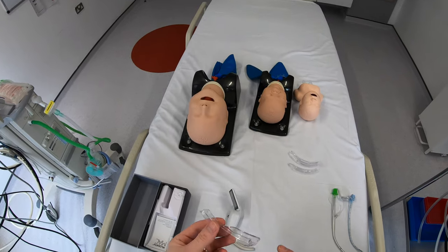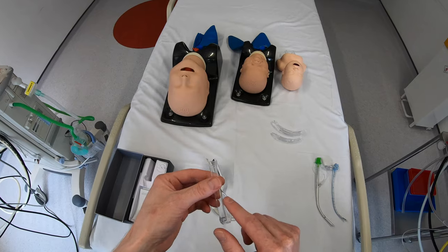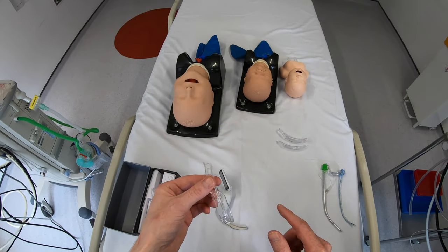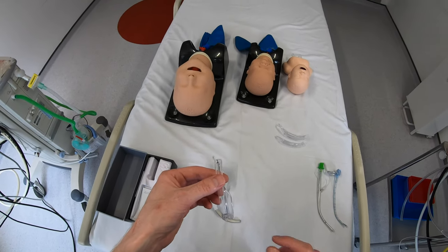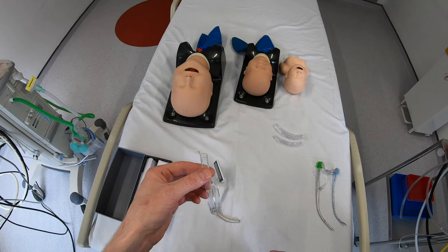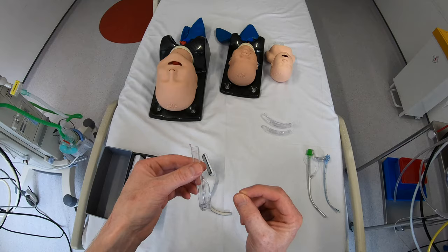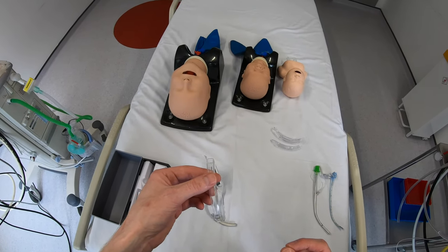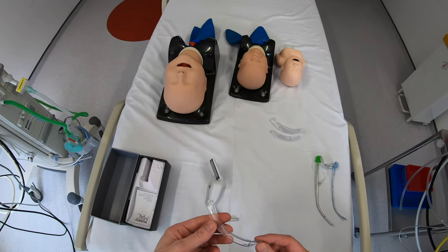The device is also quite thin in the other plane, so you have plenty of space to the right of the device in the mouth. That should give two things: plenty of space for tube delivery, and a good direct view. With other video laryngoscopes that are much thicker, you can have difficulty delivering the tube, and although you get a good view on screen, you don't get a good direct view. It'll be interesting to see how that performs today.